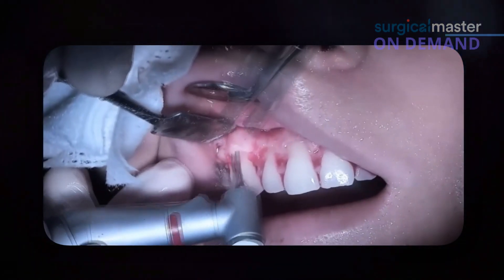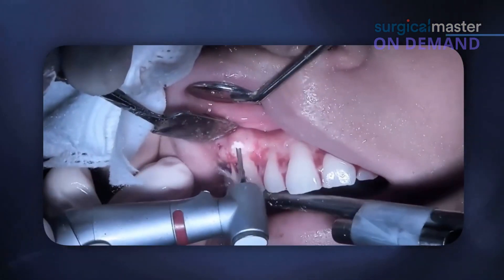Sometimes when you see all that bone it's overwhelming. Time out — don't get overwhelmed. Reduce the height first. Don't think about the thickness, you'll deal with it later.